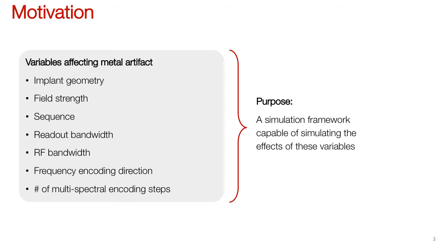Our lab is particularly interested in imaging near metal at low field strengths, including 0.55 Tesla. Imaging at non-conventional field strengths will require re-optimization of imaging parameters, and simulations can help to do this efficiently.